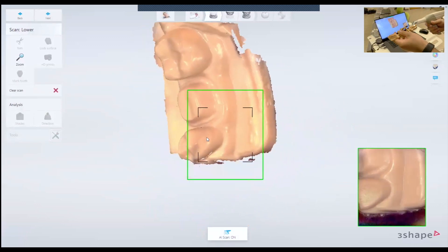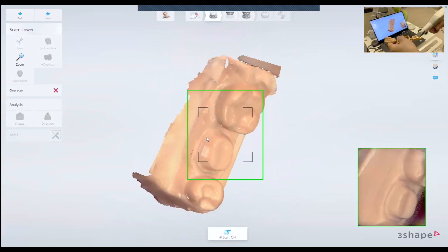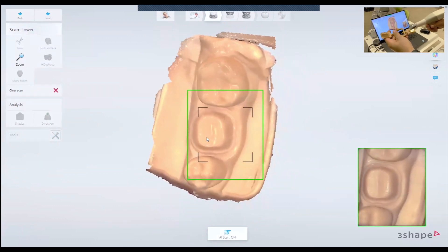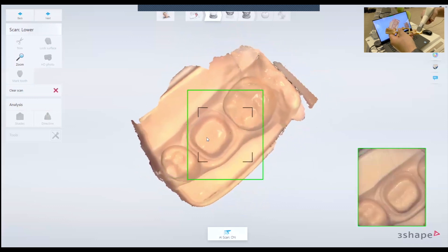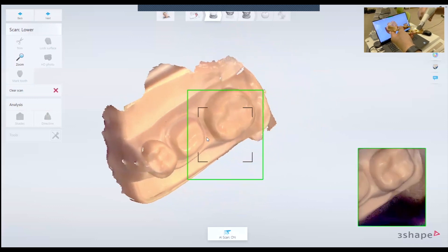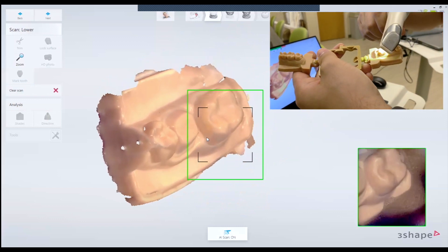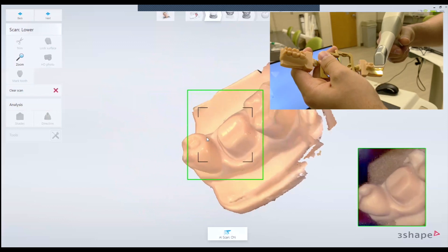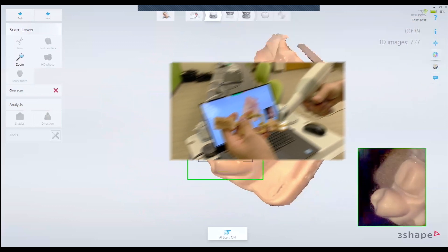Here I am scanning my model. To scan the mesial of the second molar, I rotate the scanner like this and tilt it a little bit so I can scan the mesial of the second molar. Then the same thing — I tilt the scanner to scan the distal of the second premolar.